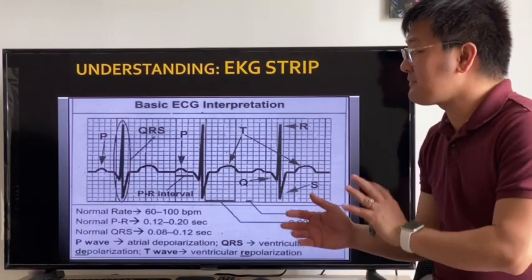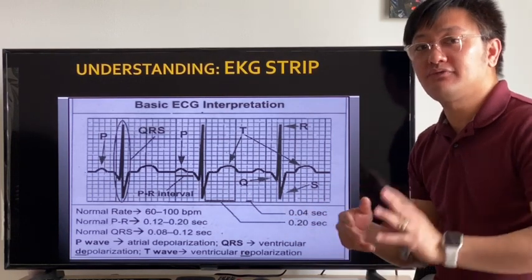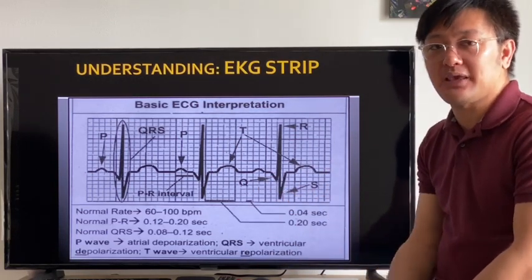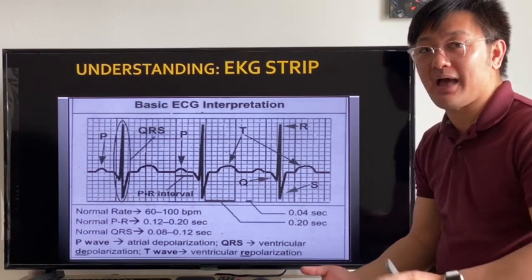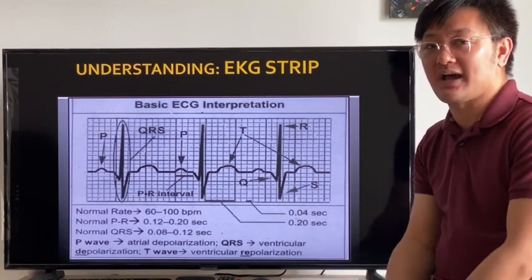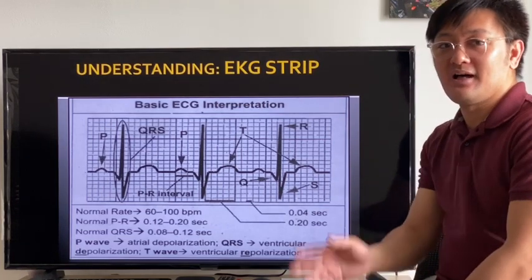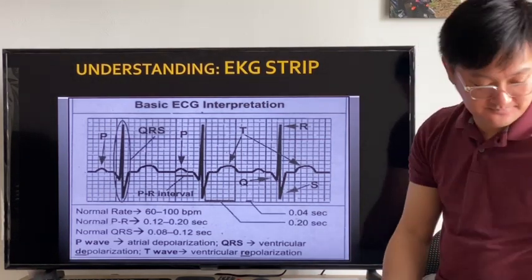Okay, so as of the moment, I want you to pause, review the different key waves, familiarize the placement of your PQRST, and we will go back and proceed to the next slide for different dysrhythmias or arrhythmias, okay. Have a pause for a while.